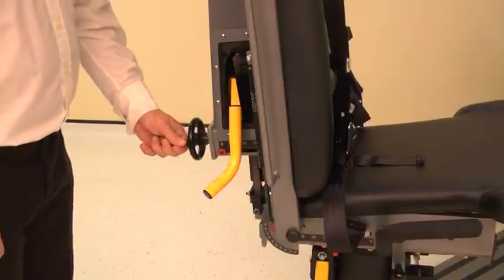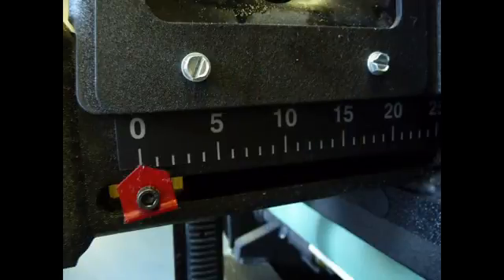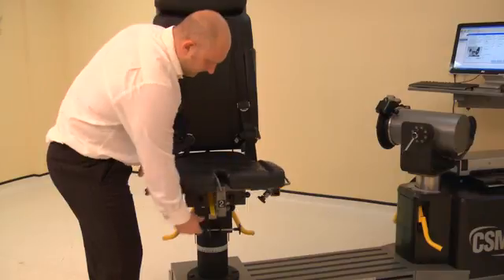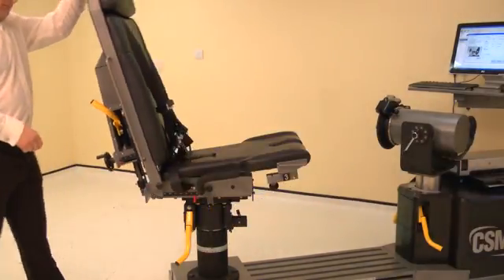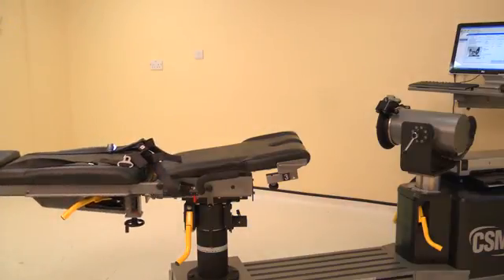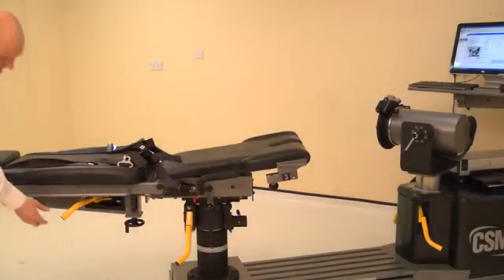Set the chair back translation by winding the handle. Adjust the chair back translation to position 0. Set the seat to the down position by lifting the seat and releasing the lock. To set the chair back angle, lift a locking handle and adjust the chair back to 0 degrees. Ensure both locking handles are pushed down to secure.